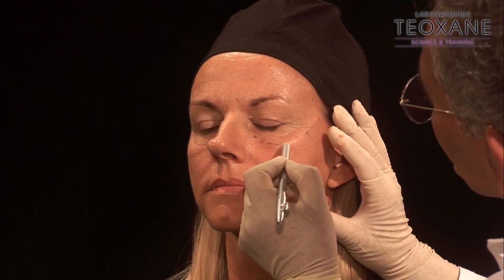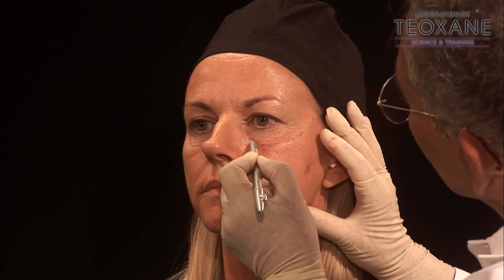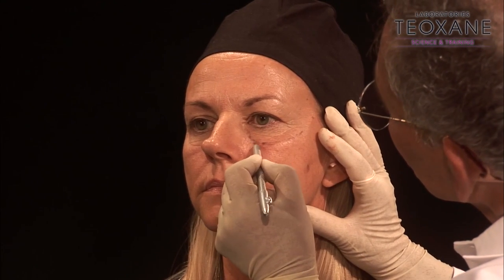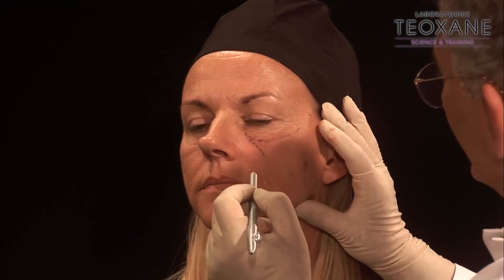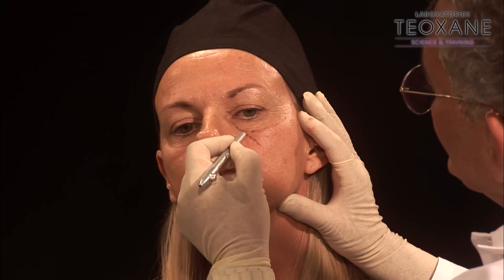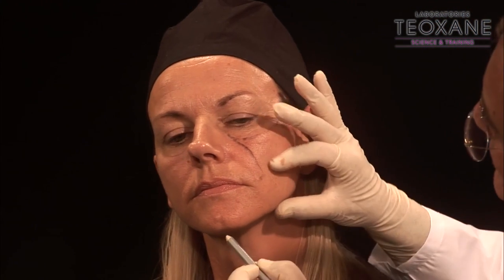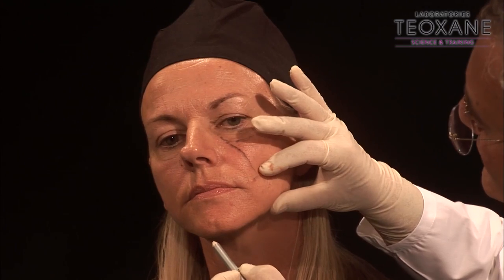Be careful not to get involved with some area you don't want to deal with. Eventually you can, for certain people, deal with the tear trough here, which I'm not a great fan. Definitely not to get involved with the eye socket area here because it's going to be lumpy. She lost some volume in the mid-face, it's obvious. Here, you see, I will stop here. It's quite lumpy here. Don't put filler in this area, it's enough.